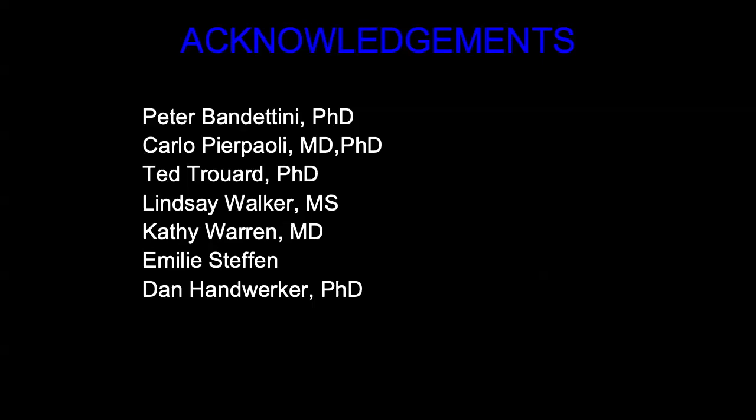It's nice to have a captive presenter to ask questions. So you said that the minimum number of directions that you need is 6. Yes. And I've often heard the joke that if you want the best DTI data, it's like, how much time do you have? But given that today is 2024, is there a recommendation for the number of directions, number of shells, number of phasing codes?